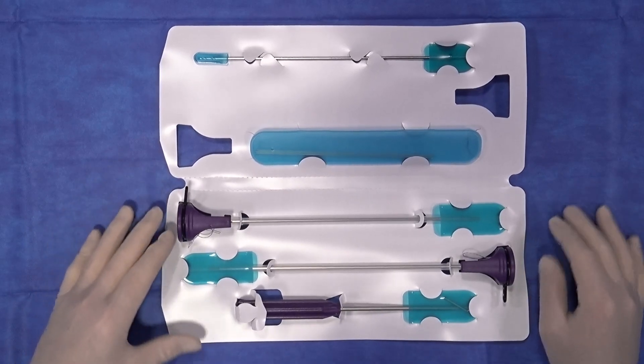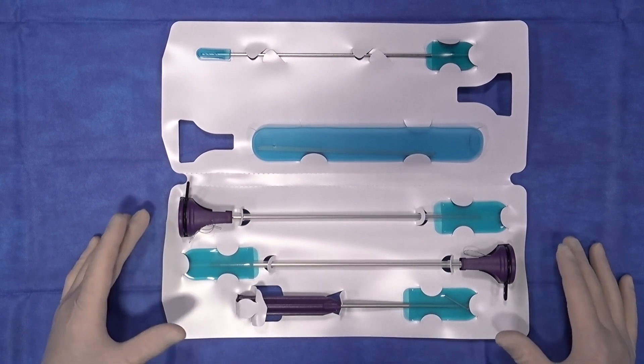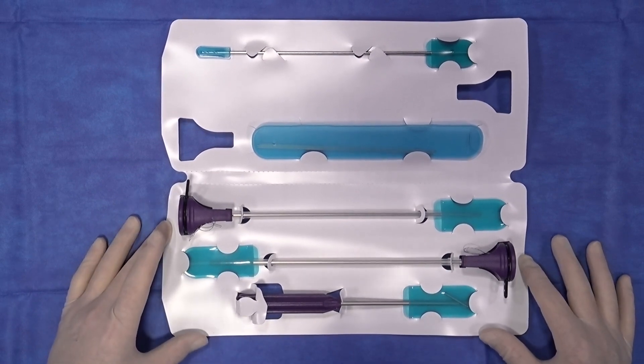This is the medial meniscal tibial ligament repair kit. It comes with everything you need to perform the meniscal tibial ligament repair.